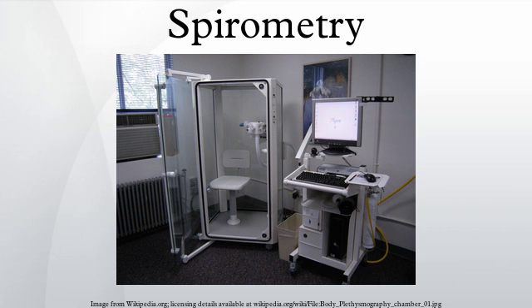25–75%. Average ranges in the healthy population depend mainly on sex and age, with FEF 25–75% shown in diagram at left. Values ranging from 50 to 60% and up to 130% of the average are considered normal. Predicted normal values for FEF can be calculated online and depend on age, sex, height, mass and ethnicity as well as the research study that they are based on.